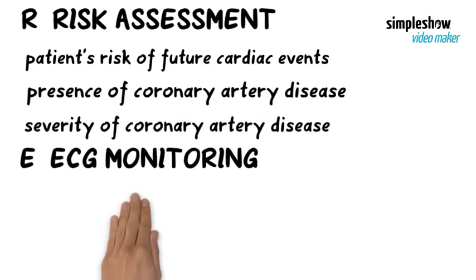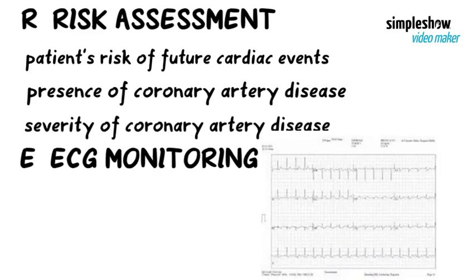E. ECG monitoring. During the stress test, the patient's electrocardiogram, ECG, is continuously monitored to detect any changes in the heart's electrical activity. This allows the healthcare provider to evaluate the heart's response to exercise or stress.